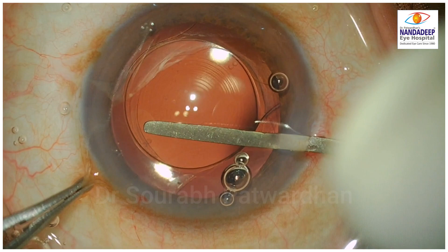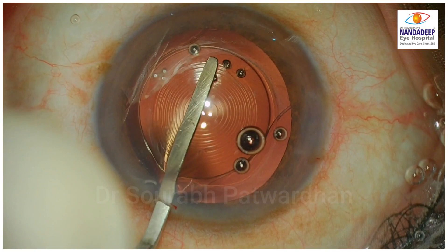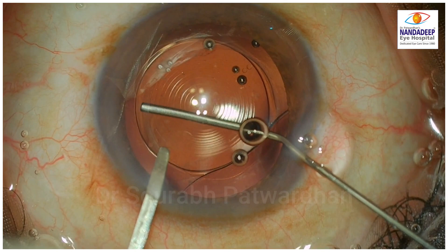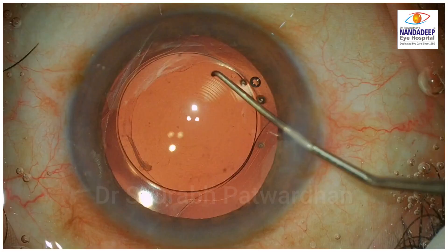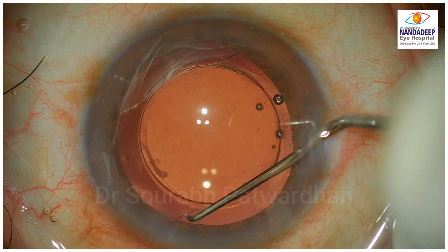However, we must be very careful because there can be areas of fibrosis where the anterior and posterior capsule are fused together — this is more common as time goes by. So even with a hydrophilic IOL, you need to carefully inflate the bag with hyaluronate (cohesive OVD) and release the IOL from the capsule so it is completely free. The advantage of cohesive OVD is that it can be removed very quickly after rotation, leaving no residual OVD and allowing the IOL to re-adhere.